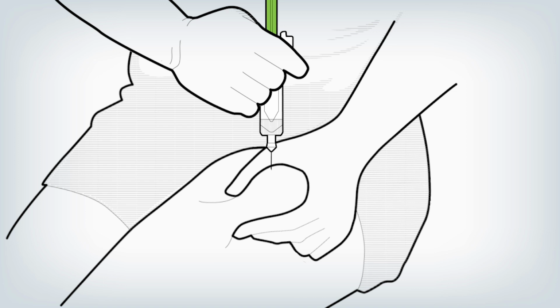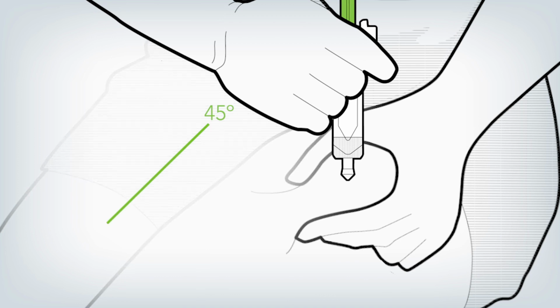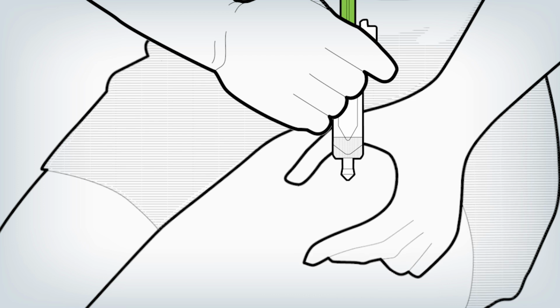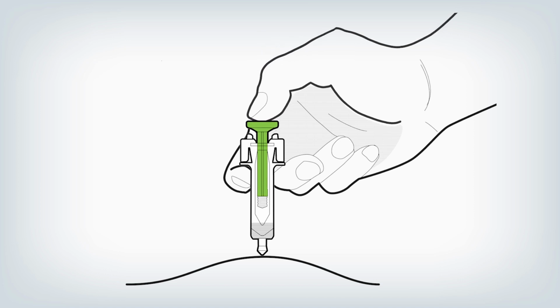Do not hold or push on the plunger while inserting the needle into the skin. The needle must be inserted all the way at an angle between 45 and 90 degrees to the surface of your skin. Insert the needle into the pinched skin with a quick, firm action. Then keep the syringe in position and let go of the pinch of skin. Slowly inject all the medicine by gently pushing the plunger all the way down without stopping. Keep an even pressure on the plunger and don't release it once you have started injecting.